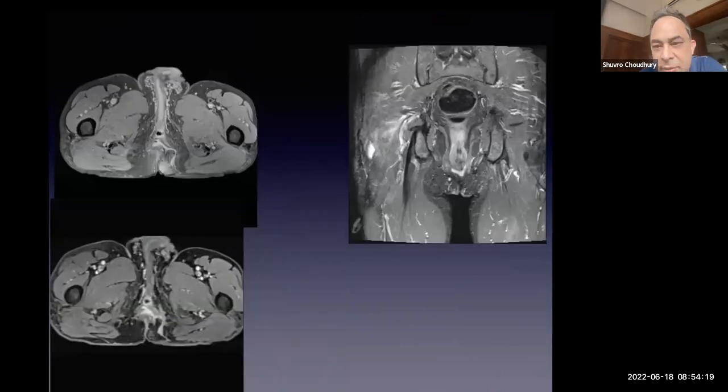Okay, so you see that the external opening is here. There is a tract. And this is what I was trying to show you. See, there is a cross tract across the midline onto the other side. See this? And from this point here, this is like a horseshoe. It's a quadrant. It's not a complete horseshoe. It's a quadrant.